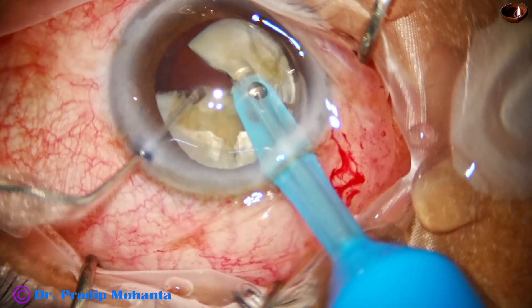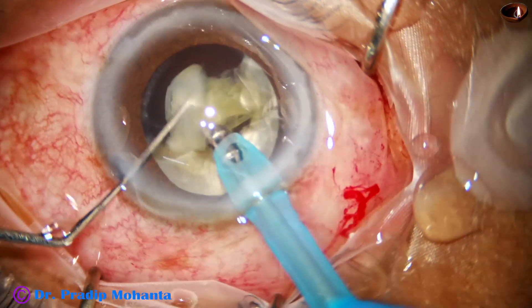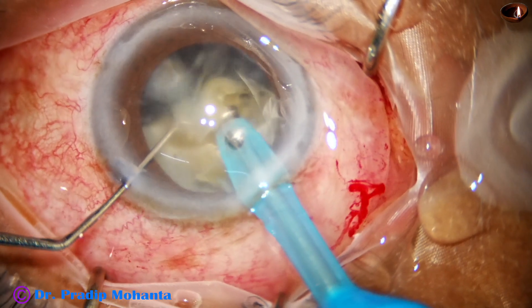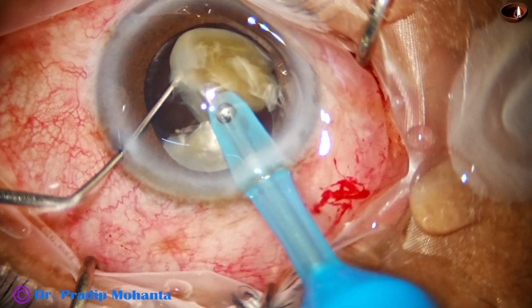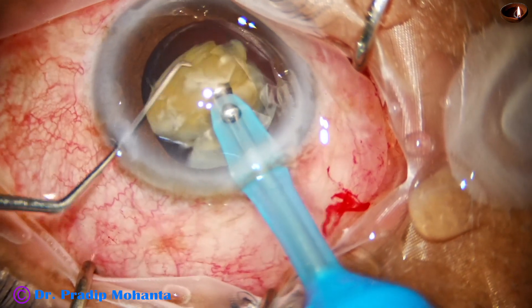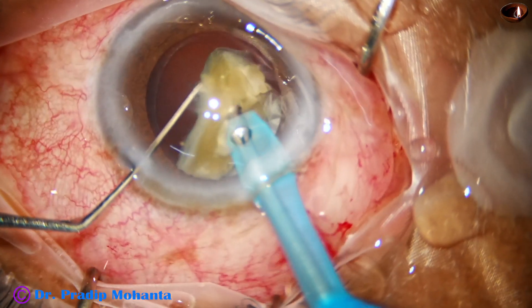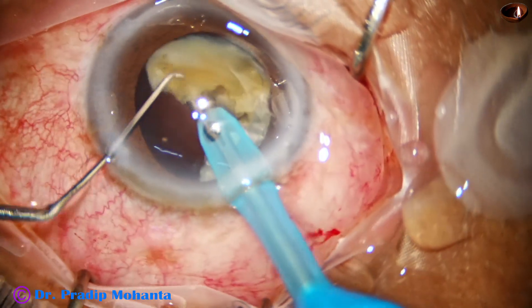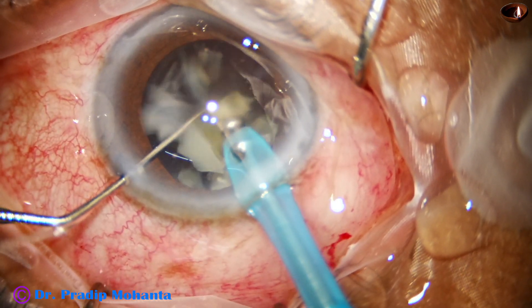By this stage, all the liquefied cortex has come out, leaving only the nuclear pieces. Close attention must be paid to the behavior of the posterior capsule, as in many instances the posterior capsule comes forward and a tear occurs at the last moment. The remaining nuclear pieces are emulsified very gradually, keeping one piece down to protect the bag.